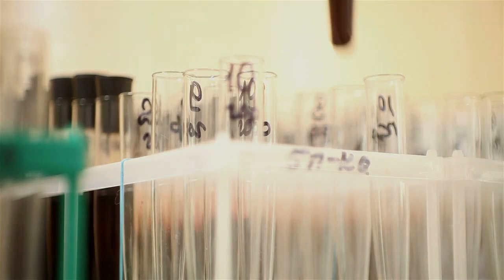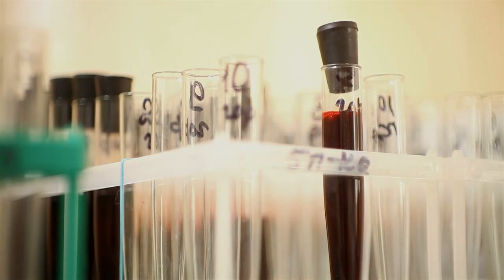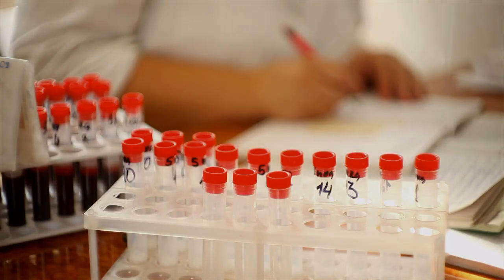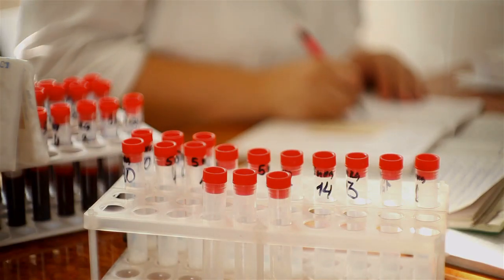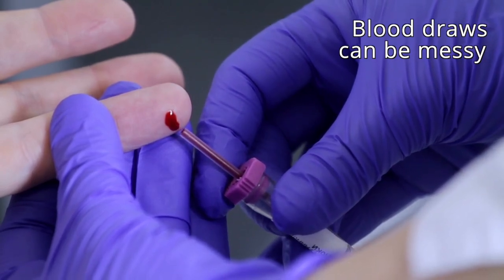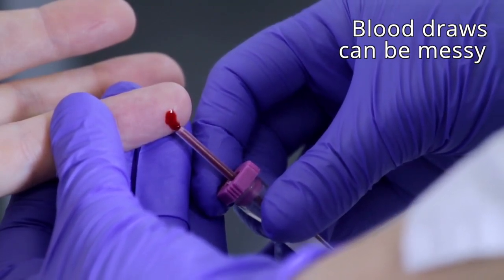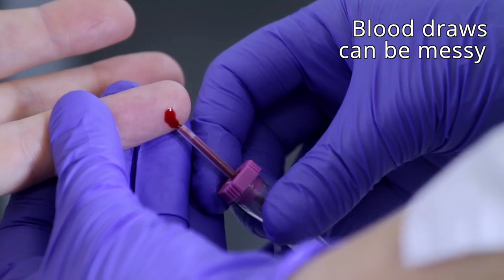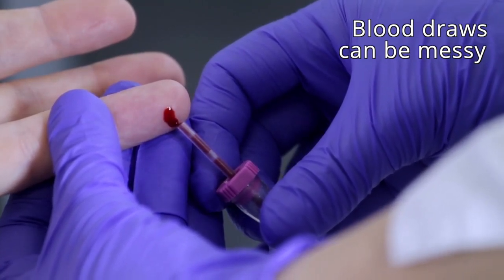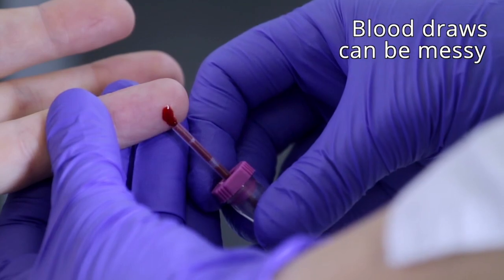Hemoglobin measurement through a blood test is widely used to screen for childhood malnutrition, a significant problem in developing countries. However, there are concerns about cleanliness with blood tests, especially in rural areas. In light of these concerns, we looked for a solution that noninvasively measures hemoglobin without the worry of handling blood, yet cheap enough for the developing world.